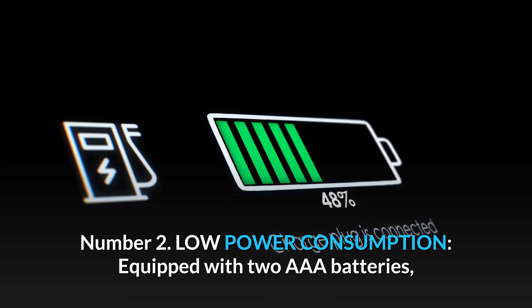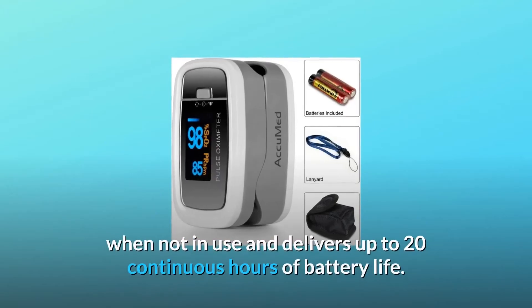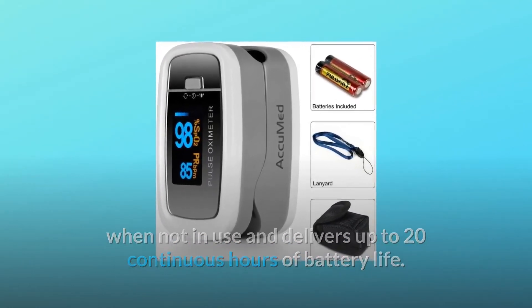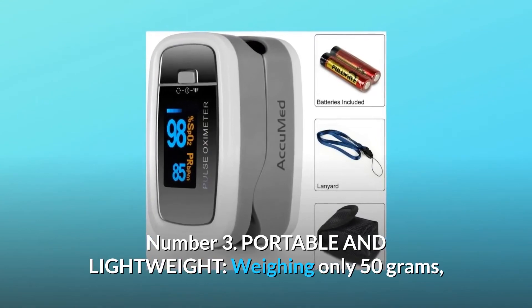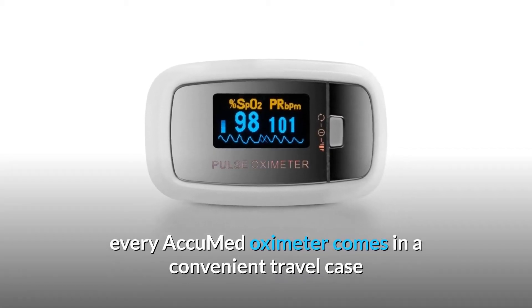Number two: low power consumption. Equipped with two AAA batteries, the oximeter automatically powers off when not in use and delivers up to 20 continuous hours of battery life.